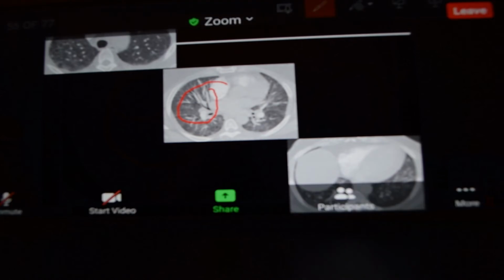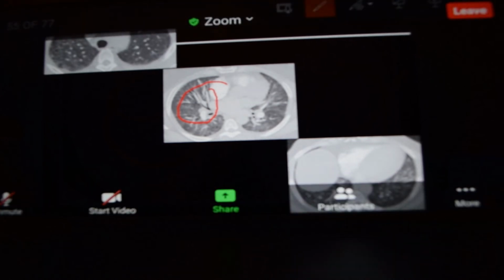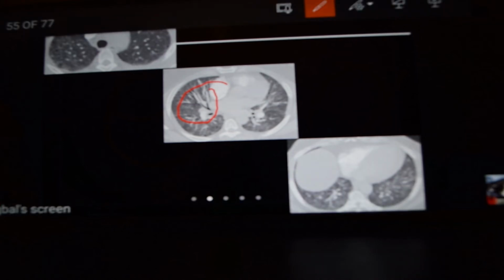So in what conditions is it seen? It is seen in pneumonias, in pulmonary edemas, in diffuse alveolar damage and in pulmonary hemorrhages, because the underlying process is replacement of alveolar gas by pus or fluid or blood or loss of surfactants. So they all will give rise to the same picture, and clinically we will have to figure out what the patient is suffering from.